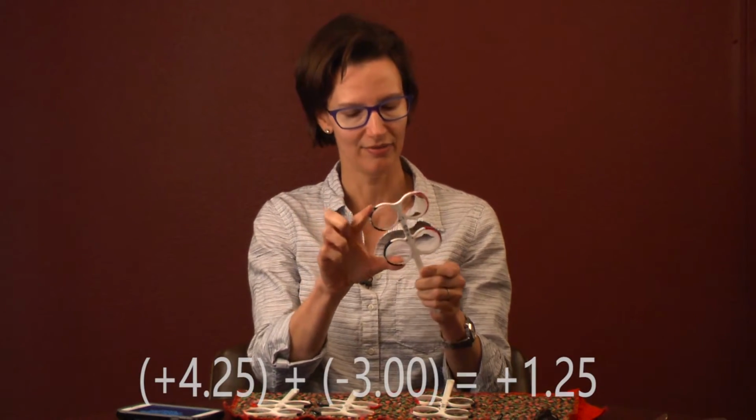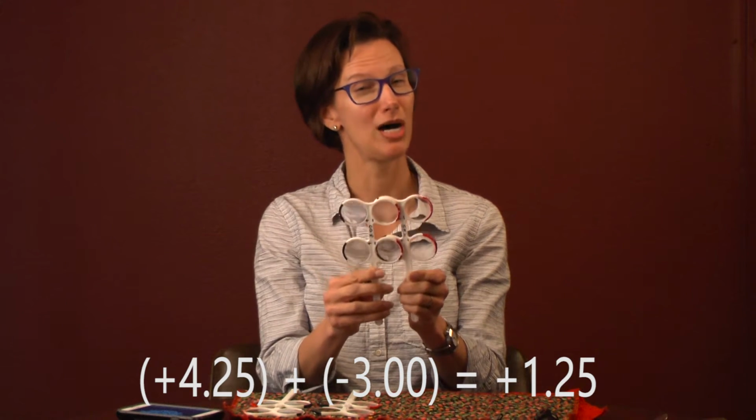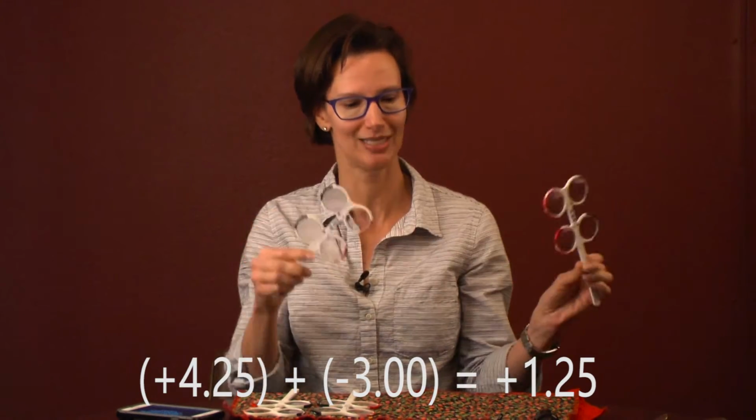So by combining the powers, if I have a positive black 4.25 and I add it to a red -3, that gives you a positive 1.25. So being able to add and subtract positive and negative numbers is very, very important. This system doesn't require any electricity, which makes it way easy and very simple to take into the countries.